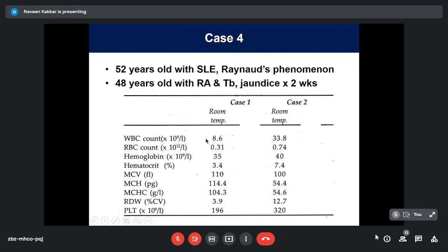In both these cases, what is happening? The rule of 3 is violated, because of which the indices are bizarre. Even the RDW is miscalculated in one of them. By chance, this is normal, may not have been. This clearly tells you, since I'm saying room temperature, at this temperature, when this is happening, expect autoagglutination of red cells. So the big ones are not a worrisome problem for us, because the big ones are going to be edited out by the machine. It is these clumps with 3 and 4, 4 and 5, which will be counted as large volumes and undercounted.